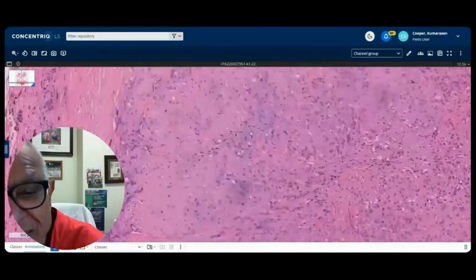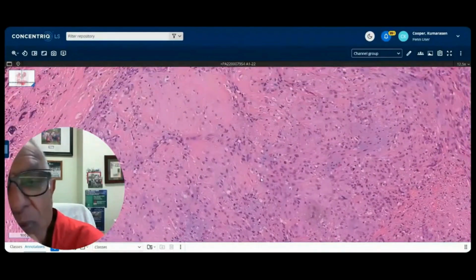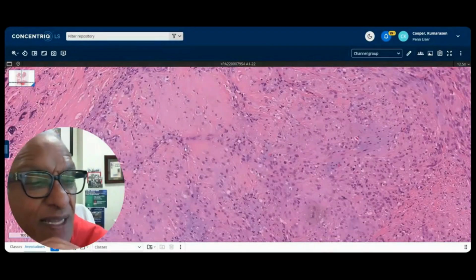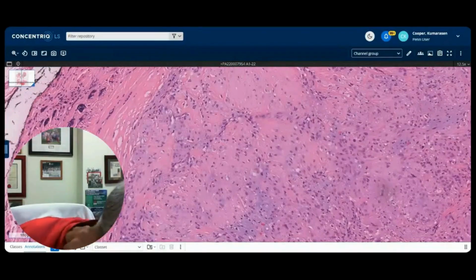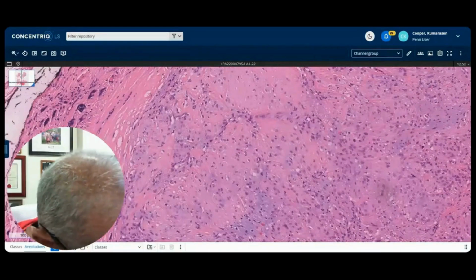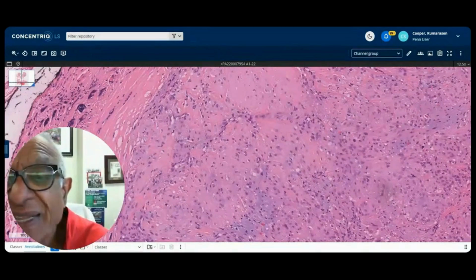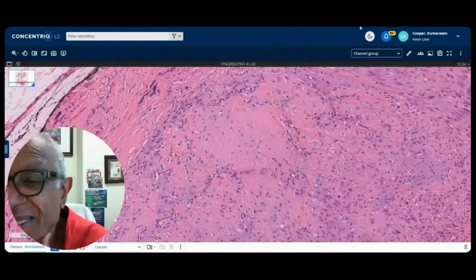But back to the tumor. Short fascicles, a little bit of blood outside there, some mononuclear cells, and then the periphery is more sclerosing. Now, this was a nodule in this 43-year-old man, and his history was that he noticed it a few months ago, but he's been following it up, and in the last few months it was decreasing in size. That was his history.